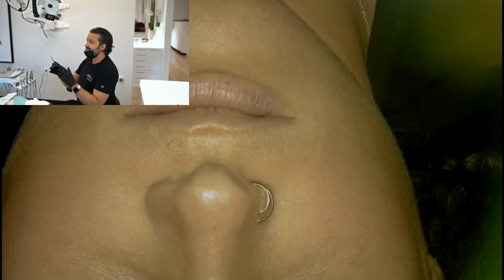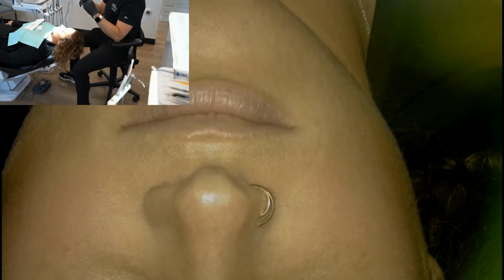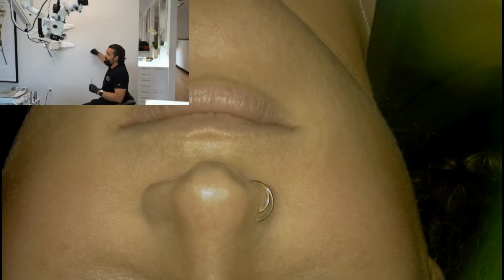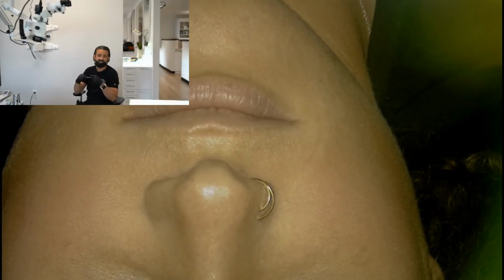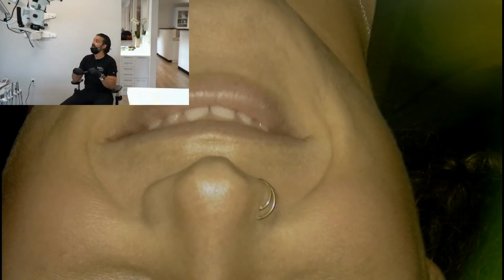The second thing is, like I said, vibrations. I'm tapping my feet, I can tap my feet and that wall's not vibrating that image. But if someone's tapping on my wall or knocking on the wall, you're gonna see that come through, and those little details drive you nuts. I mean, we're dentists, for crying out loud. Stuff like that drives us nuts.